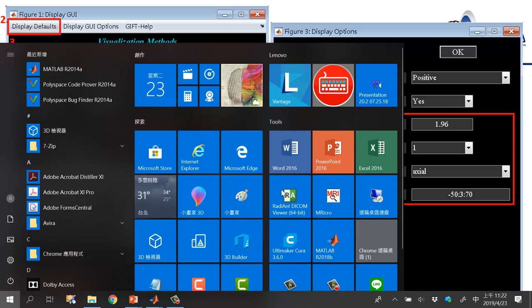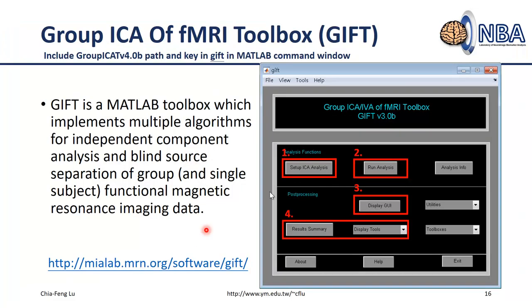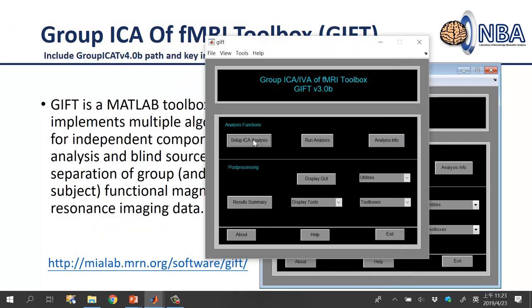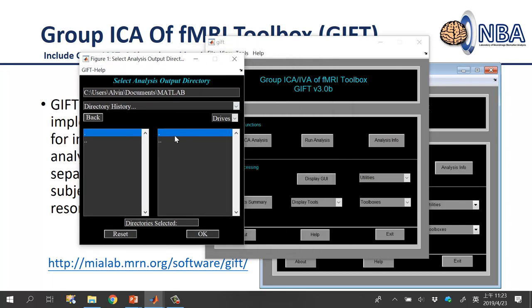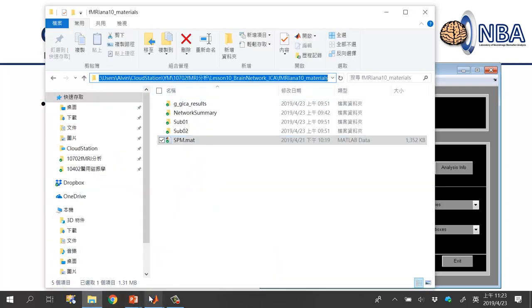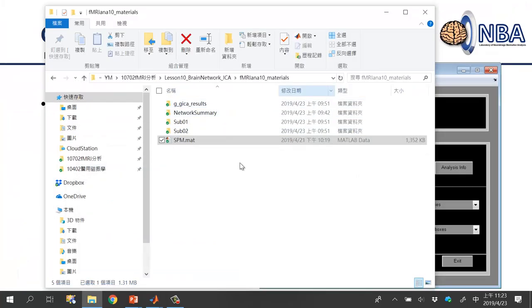Now go back to the GIFT interface. The first step is to click the 'Setup ICA Analysis' button. A file selection window will pop up — this uses the SPM8 selector, so avoid Chinese characters or special characters in your file paths. Change the current folder so you can conveniently select your files.